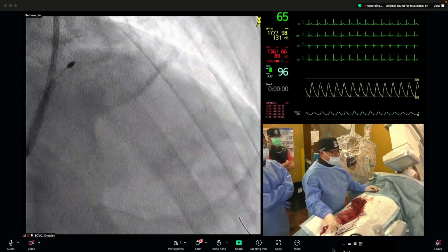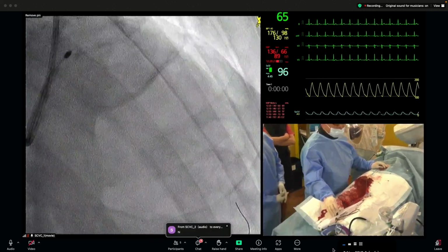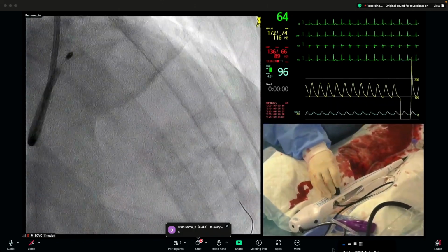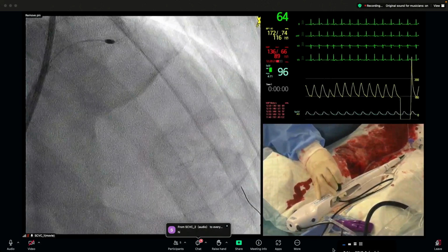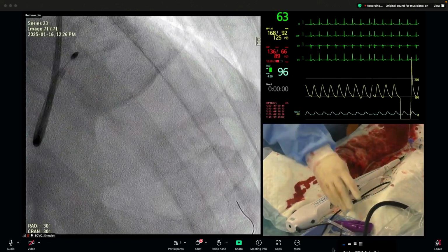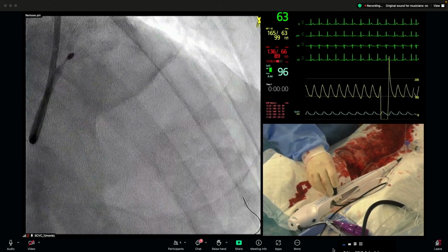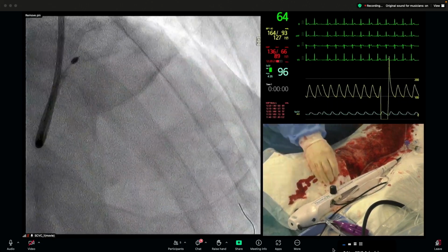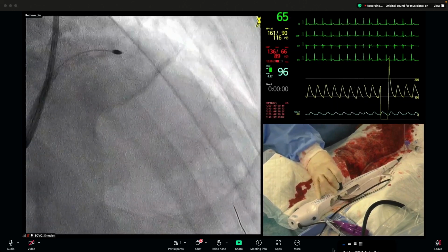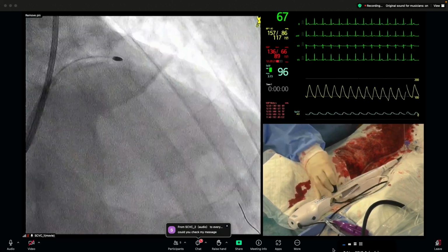This is Chen from Hong Kong. Just a couple of quick points. Last time, we didn't have any recommendation, only a class 2 recommendation for the use of IVUS. But after the ESC meeting in August last year, we have now got a class 1A recommendation for the role of intracoronary imaging for complex lesions, especially left main, true bifurcation, and long diffuse disease. I think Dr. Kojima excellently demonstrated this. Nowadays we don't have any excuse for not using intracoronary imaging for these sorts of complex cases.